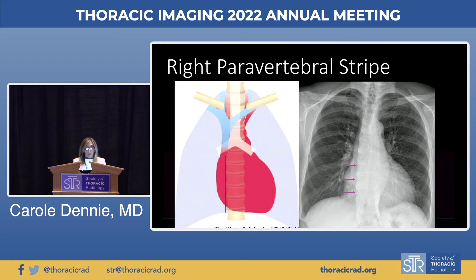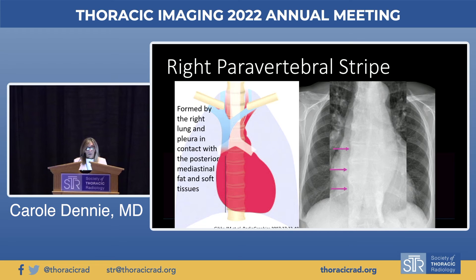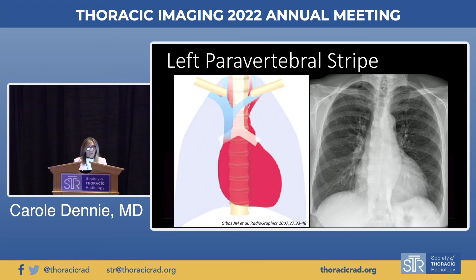The right paravertebral stripe is formed by the right lung and pleura in contact with the posterior mediastinal fat and soft tissues, usually extending from the eighth to the twelfth ribs. It may appear as a line due to the Mach band phenomenon from lateral inhibition of the retina when there's an abrupt change in density. On CT, the fat adjacent to the spine is visible. It can be widened in the presence of neurogenic tumors or other abnormalities very posterior adjacent to the spine.